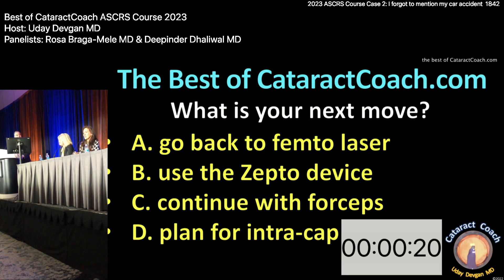Anticipating some zonular weakness — almost 360 degrees. The thing going for you here is how not dense the cataract is. If this was a 4+ cataract, would you still do it in the bag? No, I'd flip it out. Finally, one thing to agree on — visco flip it out.